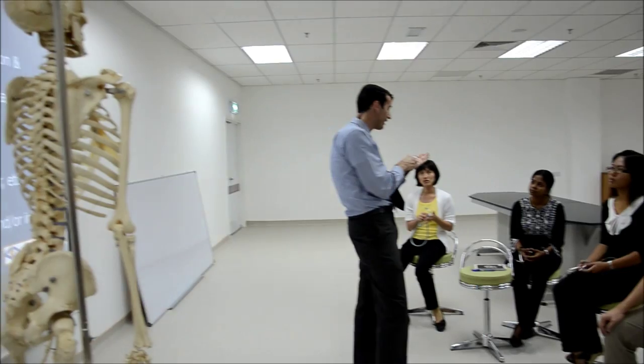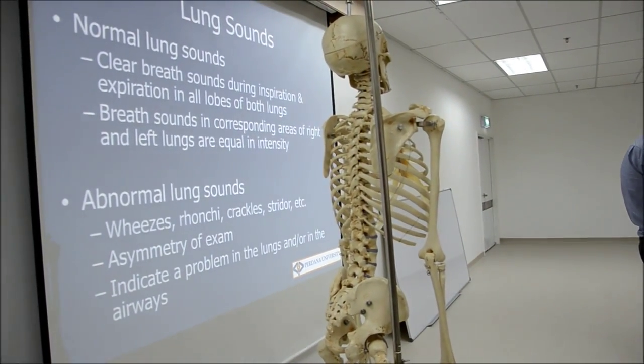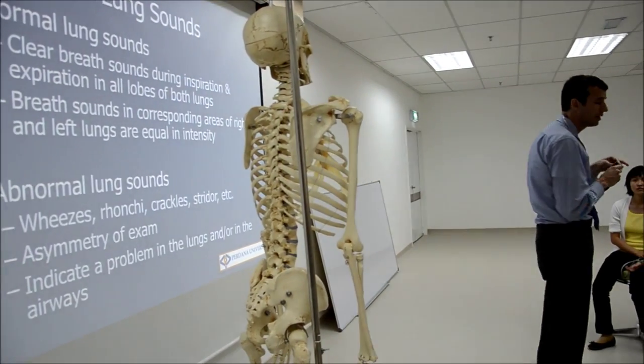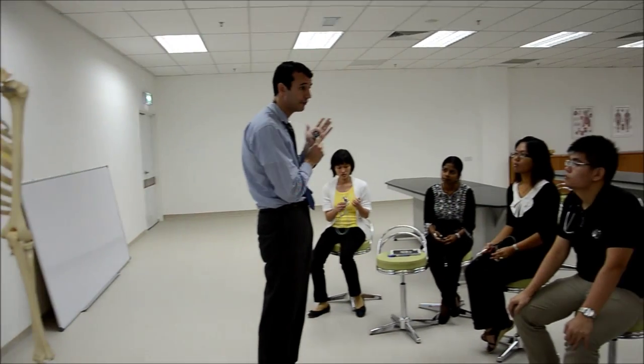And with the bell, you don't want to press hard. You just want to let it rest lightly, because if you press hard with the bell, you actually just create the diaphragm. You're not going to be hearing low pitch, you'll be hearing high pitch. But for today, all we're doing is the diaphragm. Okay, so you want to press a little bit.